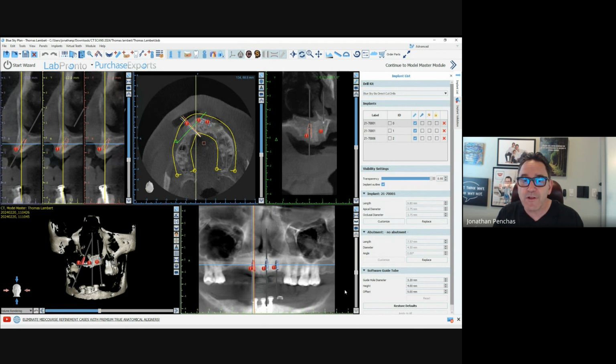They will send you a drill that is the correct size and the correct depth to where you can go almost to half the tooth, 2/3 the tooth. It depends on the curvature of the tooth. And from there on, you could either manually or with rotational devices finish your endo. But the opening of the canals and finding them will be done with a guide, with a stent. It's not very expensive. It's about $120, and it works really well for those canals where you feel I'm not going to be able to find them on my own.